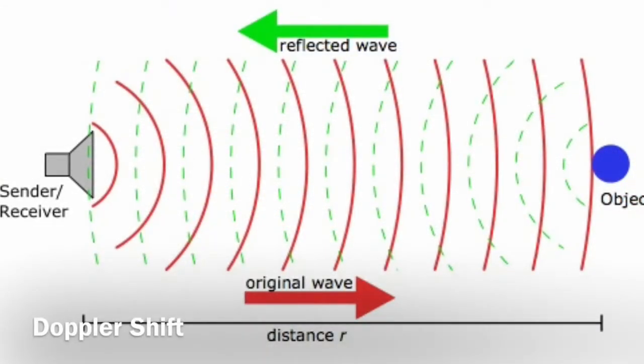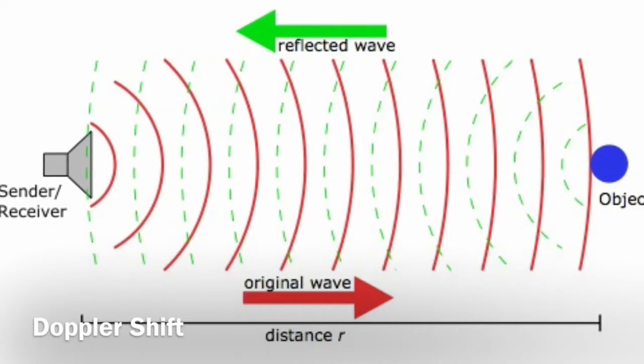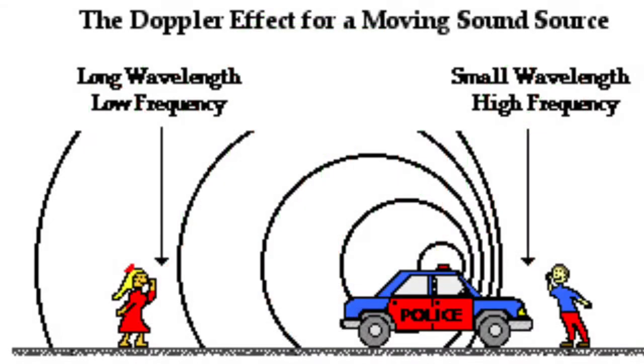The idea of Doppler depends on the frequency shift between the transmitted and received ultrasound waves. Change in frequency helps us confirm flow and determine direction. An example to that is the moving police car. As it approaches us, its siren becomes higher in frequency or pitch, and as it moves away, it decreases in frequency.